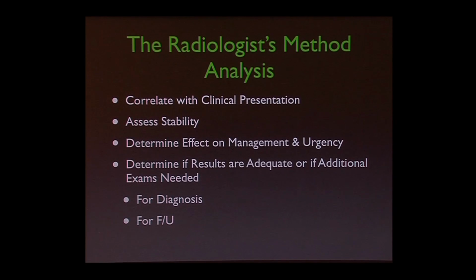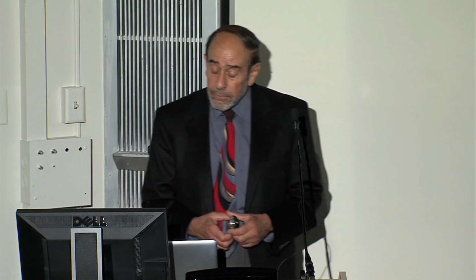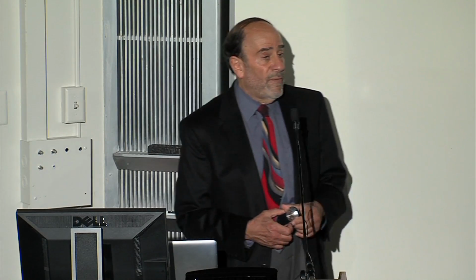Okay, so we also have to correlate our findings with the patient's presentation, where this is our analysis part, and assess the stability. How does it look compared to the old exam? Is it worse? Is it better? So we're not just looking at one image in a vacuum. We're looking at multiple images, a chest X-ray and a CT and an old CT, et cetera. And we're then trying to determine the effect on the management right now and how urgent is it.